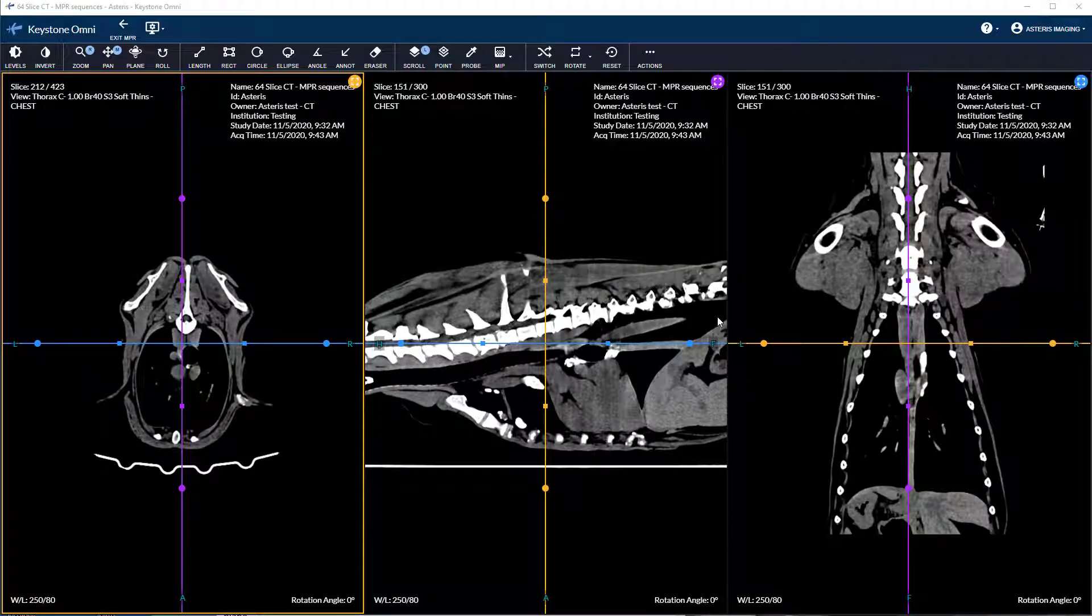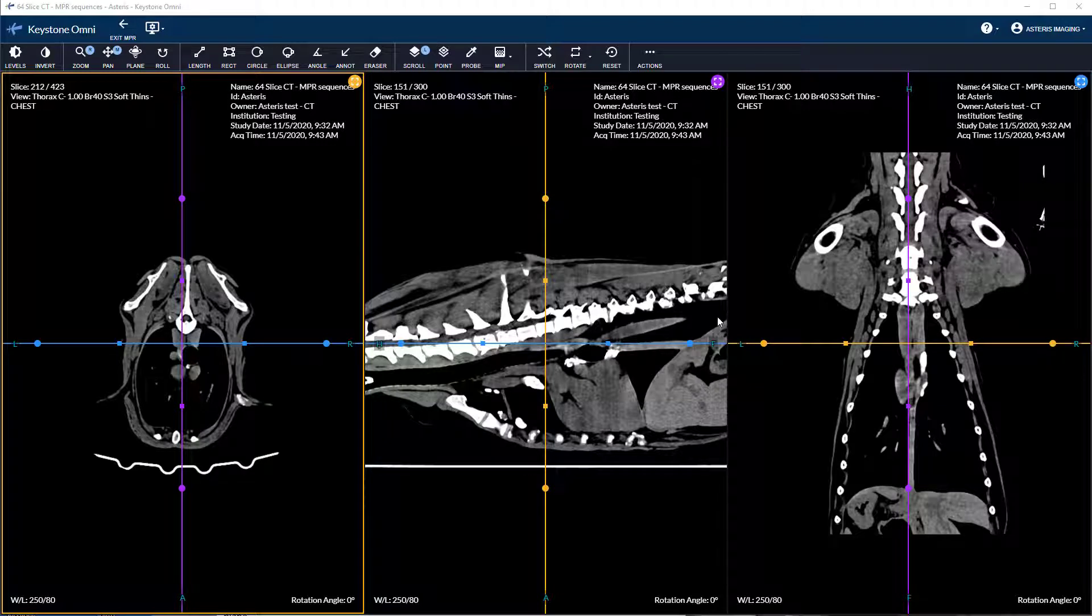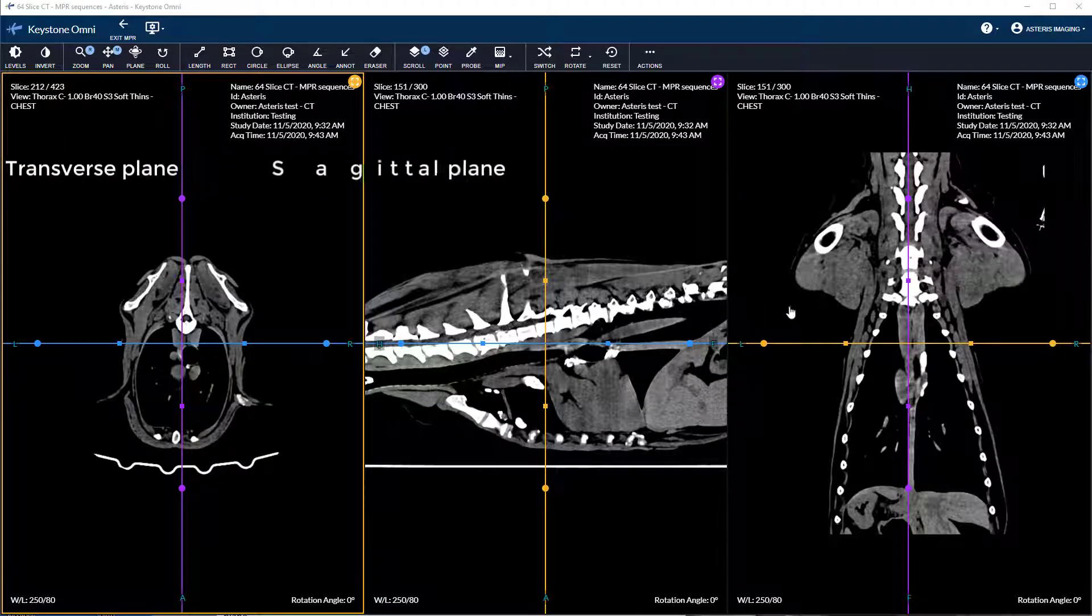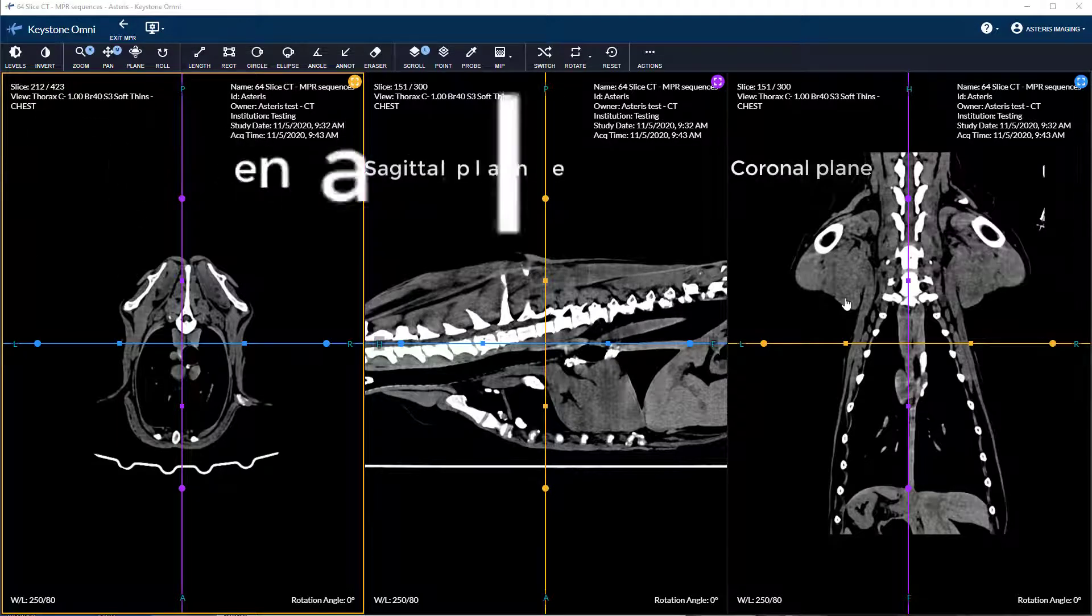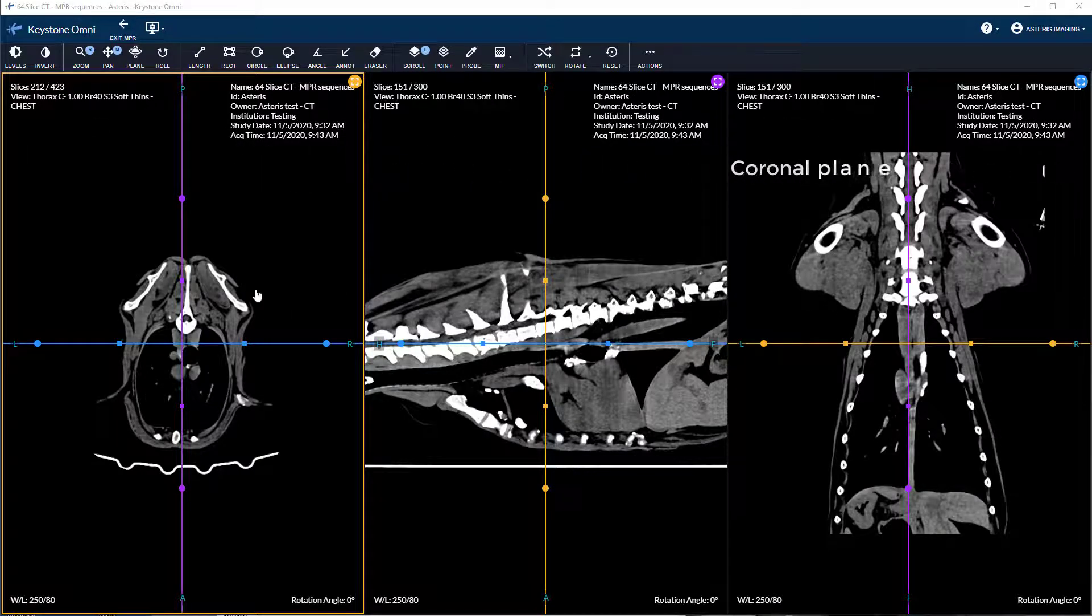Let's get into the viewing panes. As you can see I have the transverse, sagittal, and coronal planes available in a 1x3 canvas set to default.